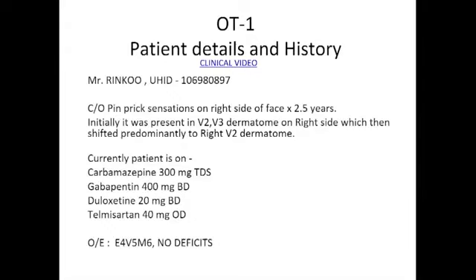This is the third molar. You can see the foramen ovale. You have to find the maxillary sinus. Just lateral to it, you will find it. And this is almost the mid-pupillary line where you are going.